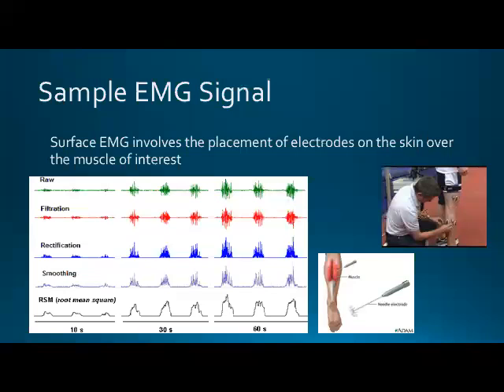experiments that are not necessarily utilizing humans. They are used in humans, but if you see like really basic research done with like reflex properties or muscle contraction properties of like mice, rats, cats, frogs, they're usually always going to use the intramuscular EMG. You'll find it in humans, but probably not quite as common.